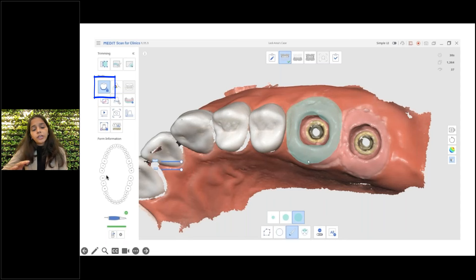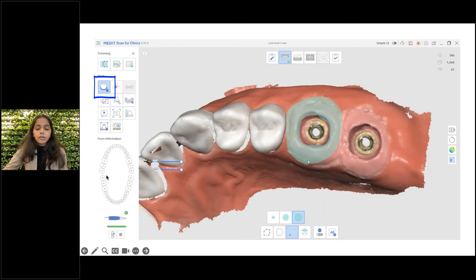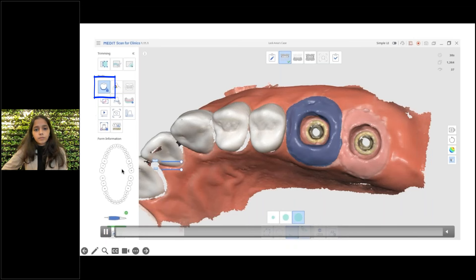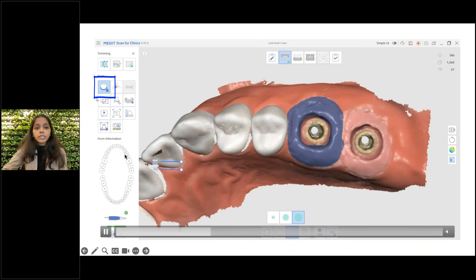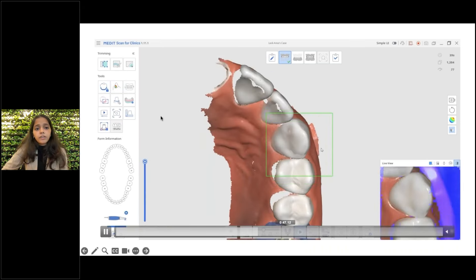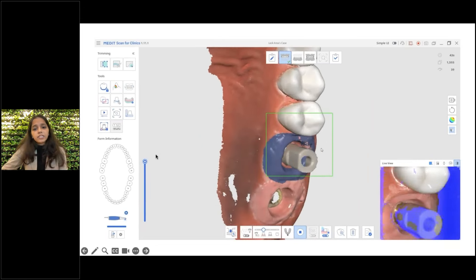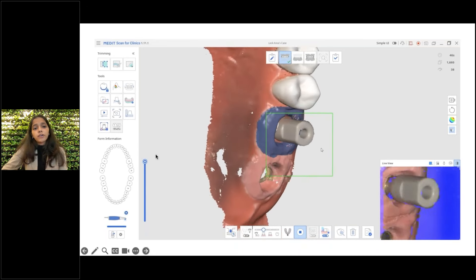The function of the lock area tool is: when you select the surface of a scan and then scan again, it will not alter that locked part — whatever tissues or noise are around it, it will not alter that area. Here I have selected and locked this gingiva area using the lock tool. After locking, I am scanning again — and as you see, even after scanning there are no changes on the gingiva in that area.